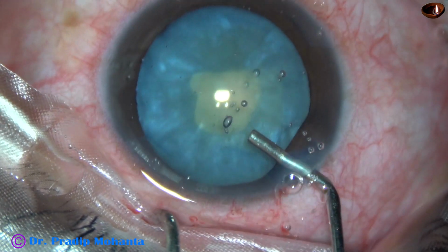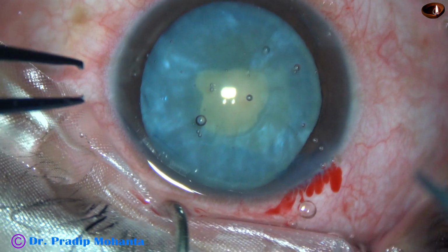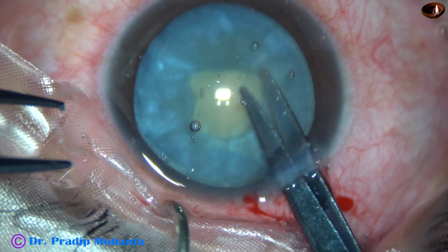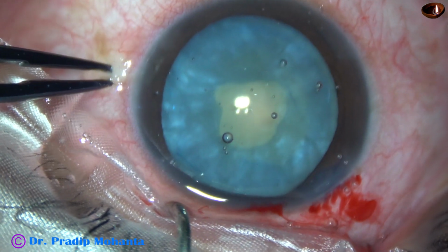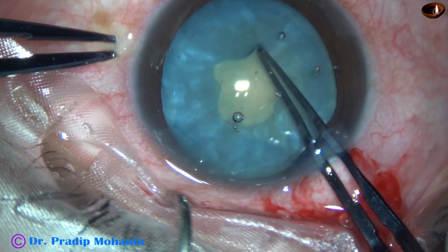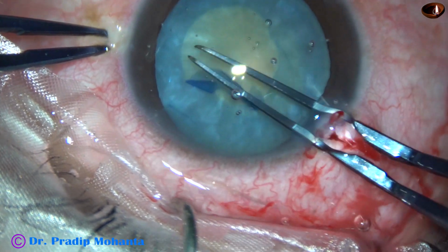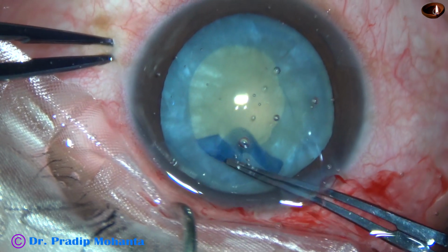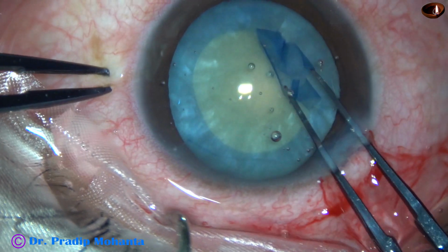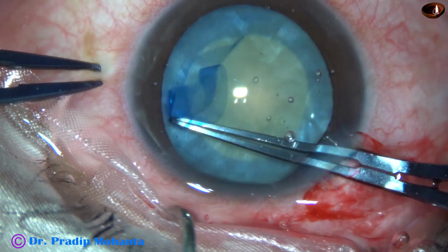In this case, the mini rhexis has already been done, some superficial cortical lens matter has been aspirated, and now with the help of a Vannas scissor a small cut is made at the margin of the mini rhexis. The Utrata forceps is taken again, and this is how you enlarge the rhexis. At this time there is no tendency of the capsule to run to the periphery. So this is a nice technique to do capsulorhexis in intumescent cataracts.